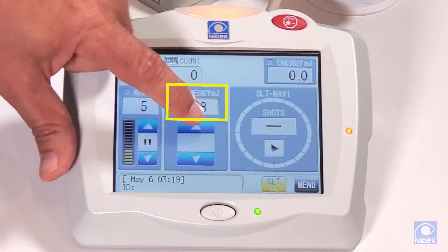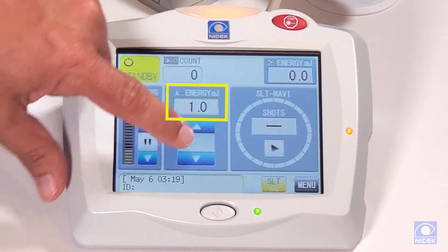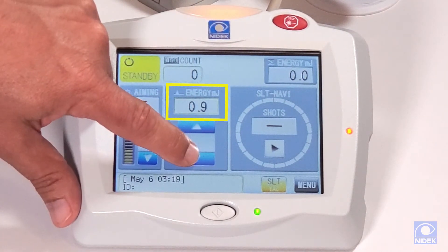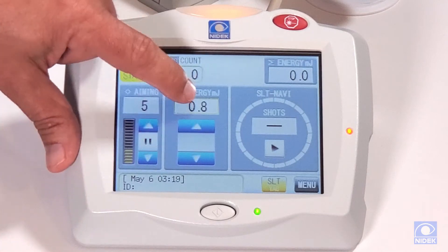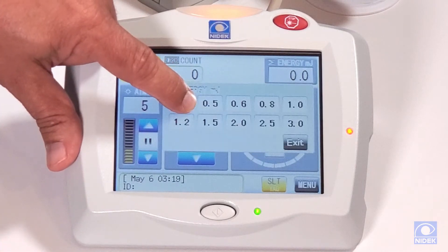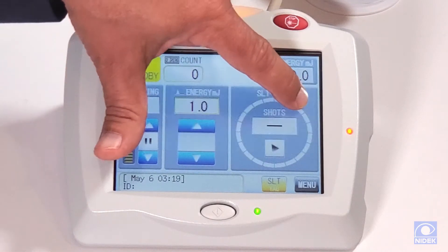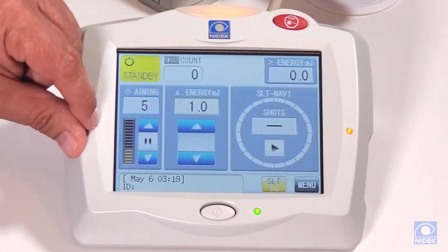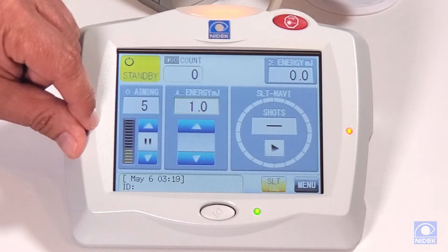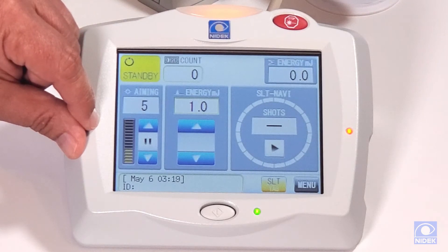This is our energy level, which we can increase and decrease. You can also hold down and select a higher amount for quicker access to a higher energy level.